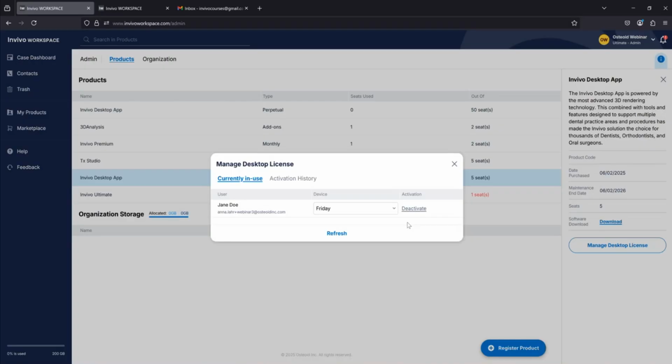This is also a great way for our IT admins to make sure that licensing is staying where it needs to be when it comes to activations. Sometimes some users may take it home with them by accident or take it with them to a specific course. And this helps rein it back in as well, to make sure that it's active on the devices that we need it to be active on and that nobody is taking it elsewhere, so to speak.